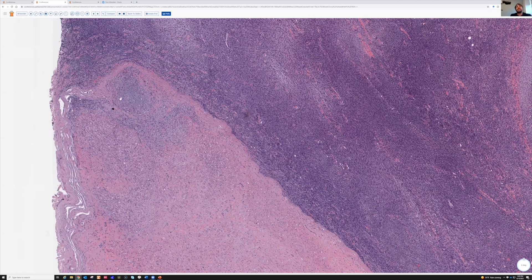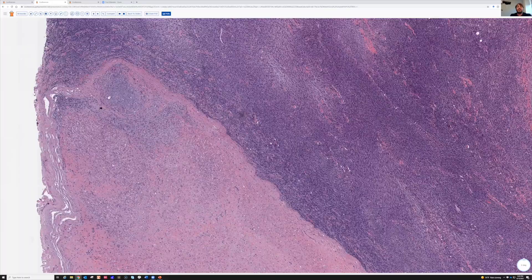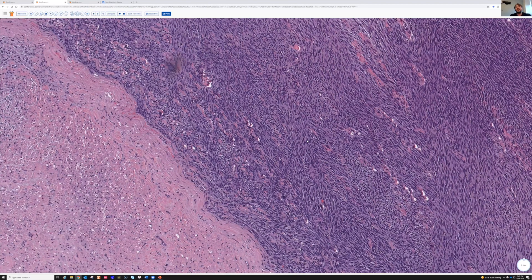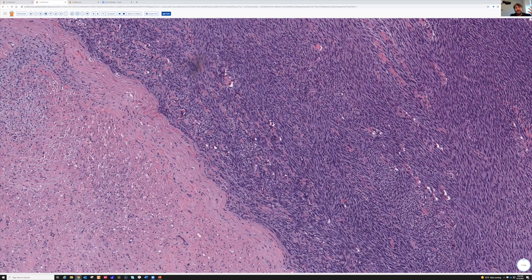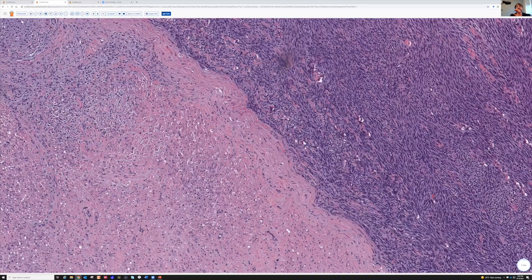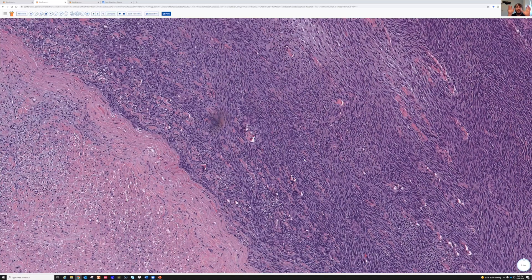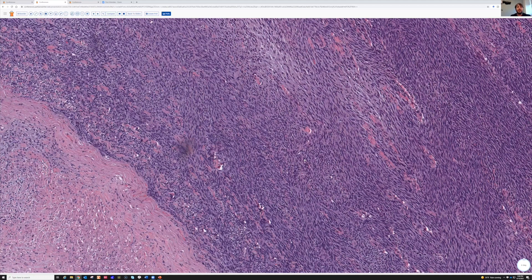More recently there is a stain that can be very helpful called H3K27ME3. It's a histone methylating protein that stains the nuclei of most tumors, but its expression is lost in the majority of MPNSTs — especially in MPNSTs outside of the setting of NF1. That's really helpful because outside of NF1 is when it's hardest to make the diagnosis of MPNST. These tumors are quite aggressive and unfortunately often have a bad prognosis, so it's important to recognize them.